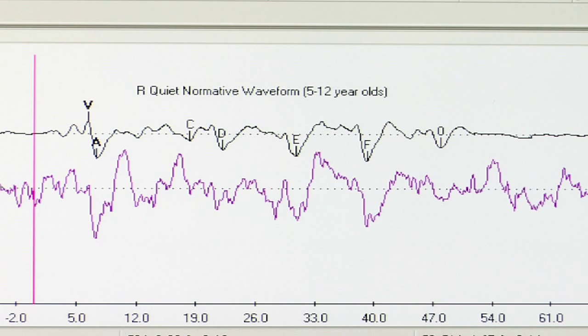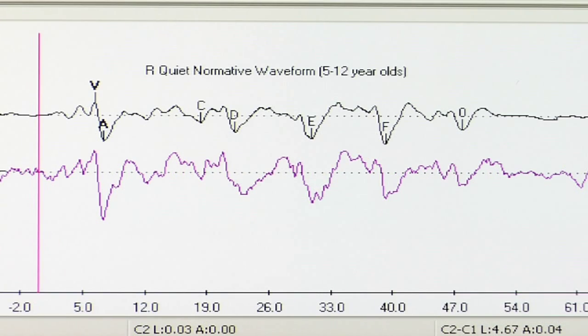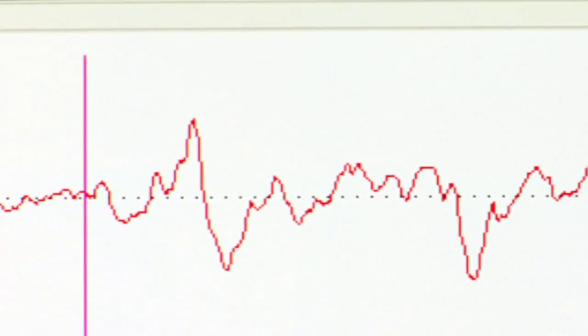Waves 5 and A are now apparent, and the noise floor is becoming smaller. The program will stop automatically when 3,000 responses have been obtained. This is what the first trial looks like.